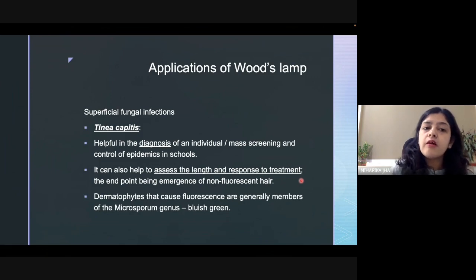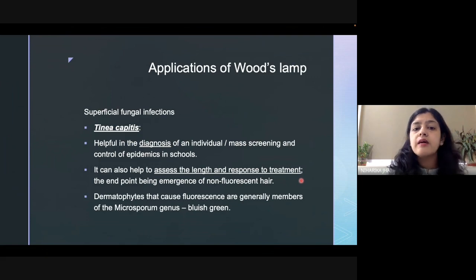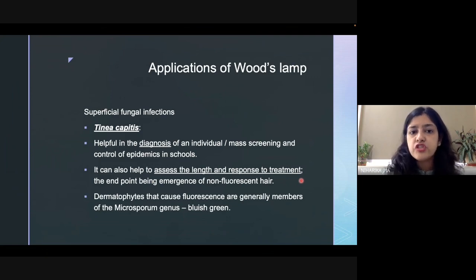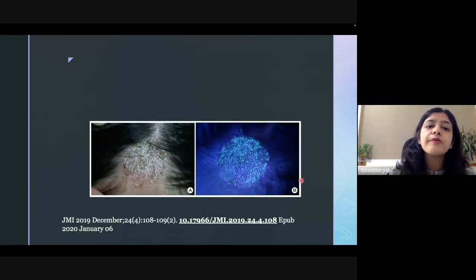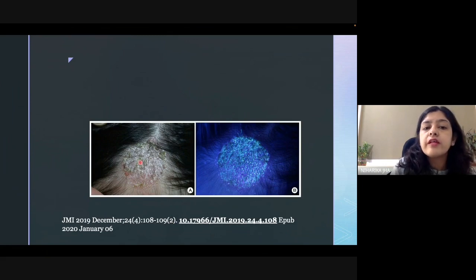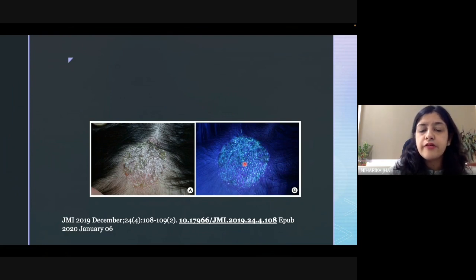A patient with tinea capitis will show a positive fluorescence at the beginning of treatment, and the result should turn negative by the end of treatment. This is how Wood's lamp can be used in diagnosing and assessing the length of treatment, and helps us in differentiating tinea capitis from other probable differential diagnoses. This is a picture showing tinea capitis with bluish-green fluorescence visible in this patient.